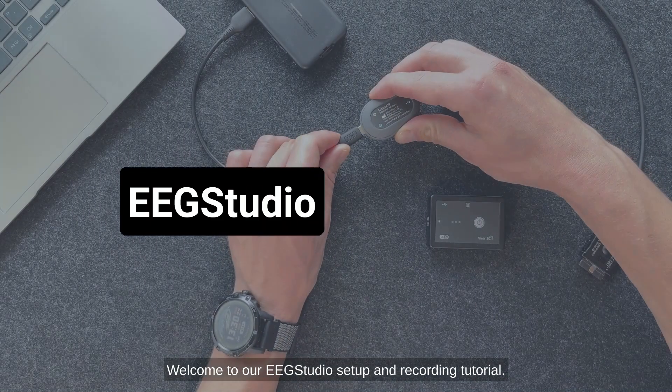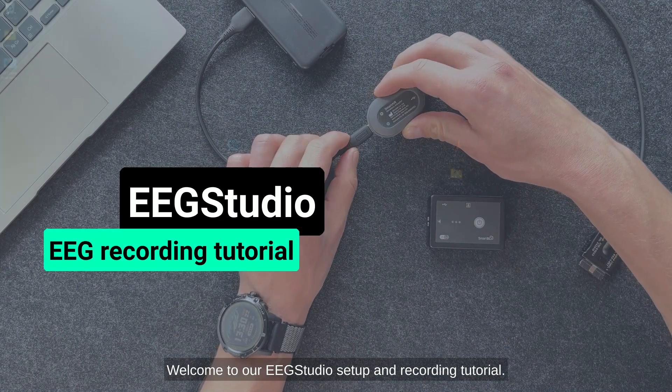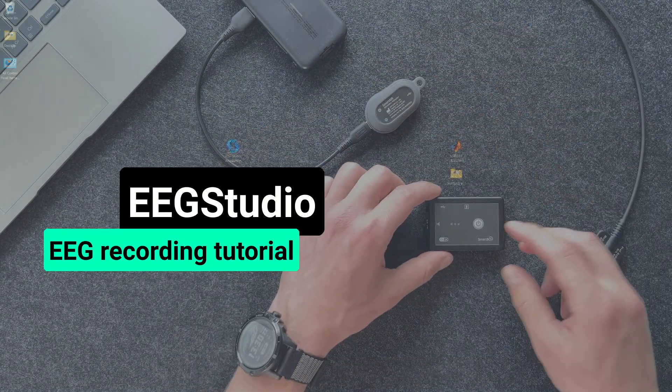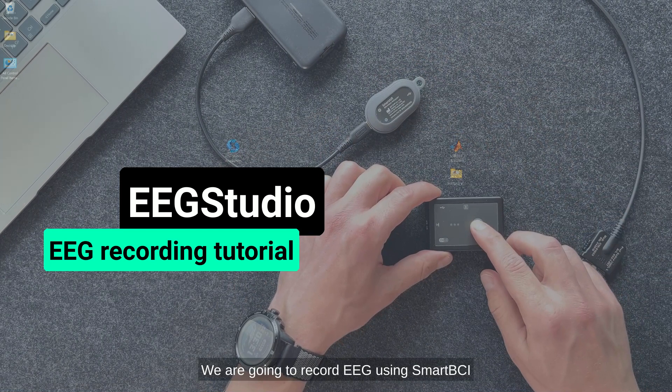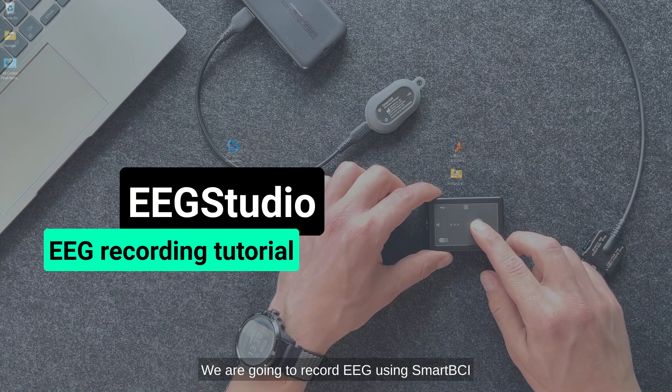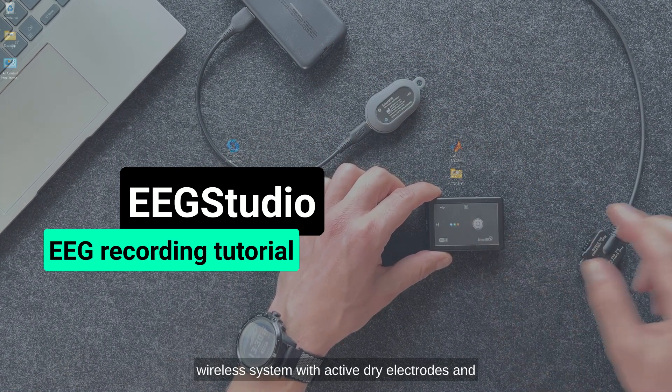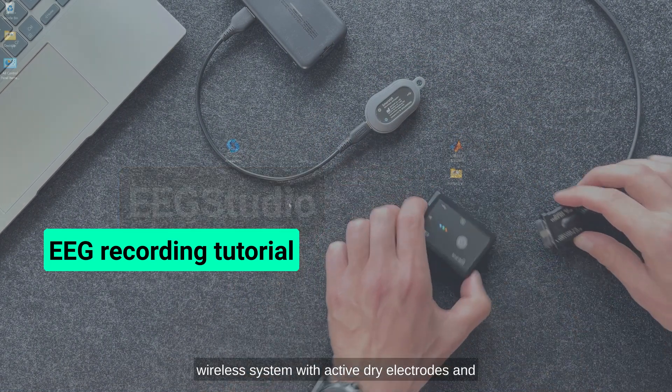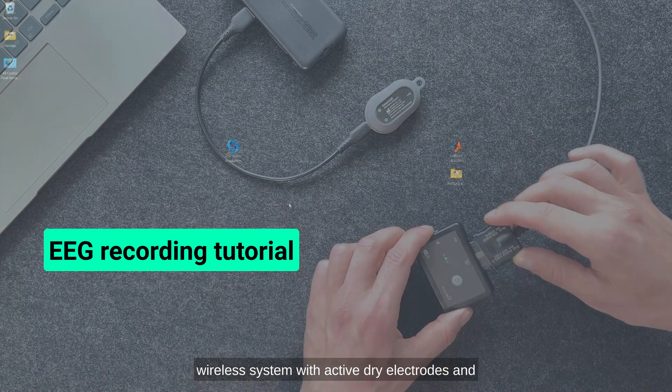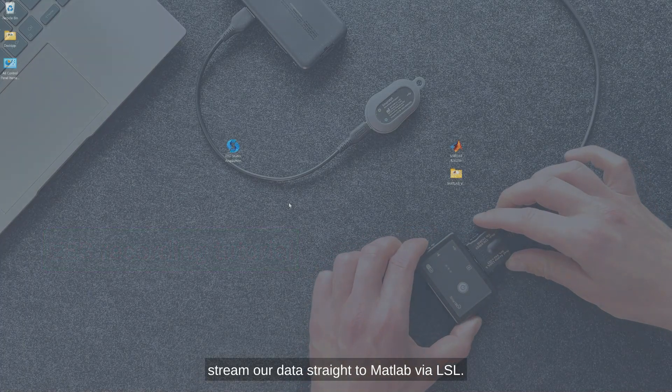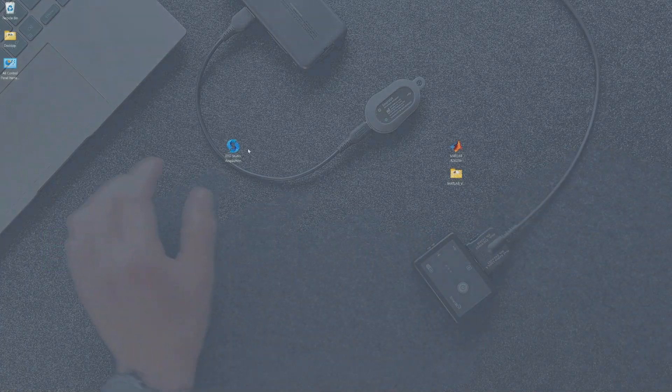Welcome to our EEG Studio setup and recording tutorial. We are going to record EEG using SmartBCI wireless system with active dry electrodes and stream our data straight to MATLAB via LSL.